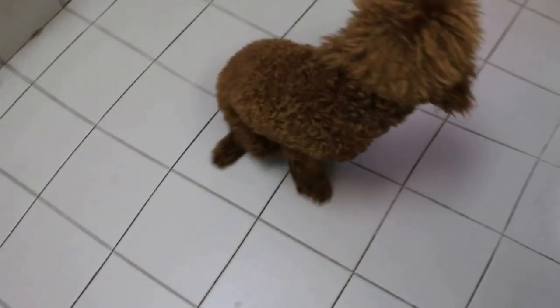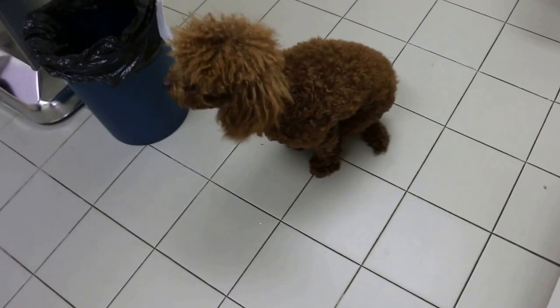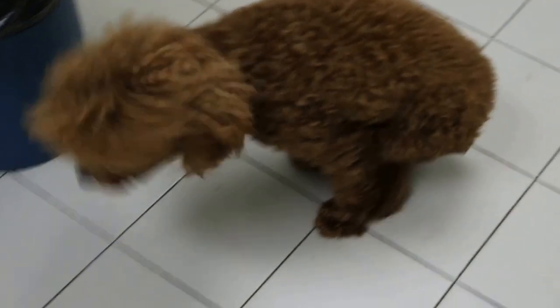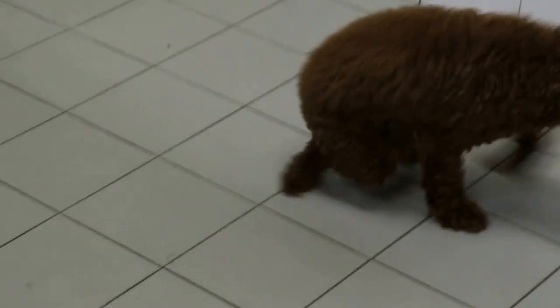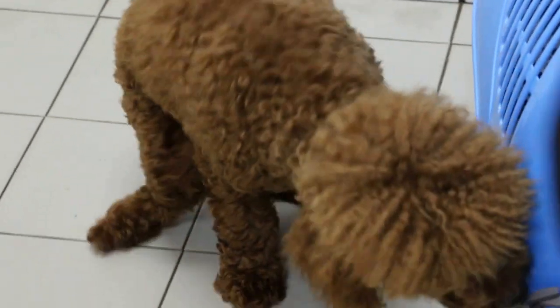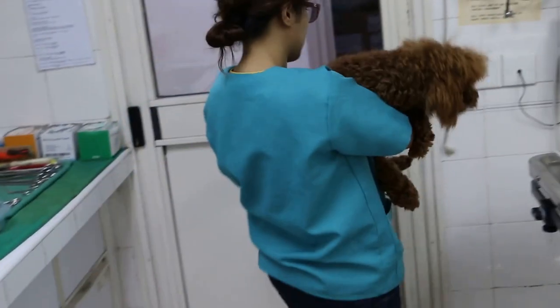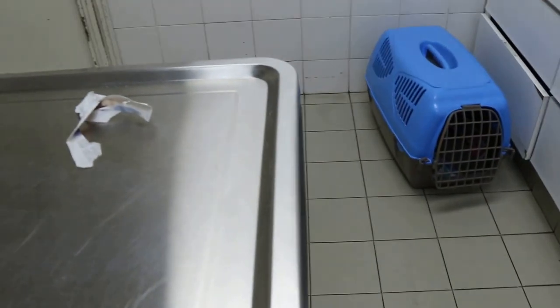It looks like a duck. How long was it? Two months. First one was the left leg — the left leg was first. Then after one month later the right leg. The dog was eight months old, March 2016. It jumped up from the playpen fence, the left leg got stuck. Then one month later the right leg also had the same deviation outwards. Now let's go for x-ray — see the growth plate of the tibia.